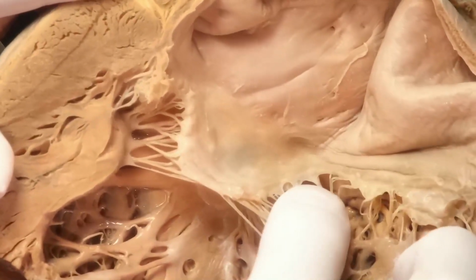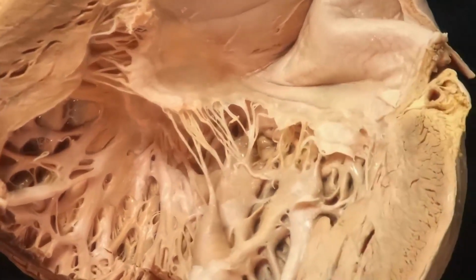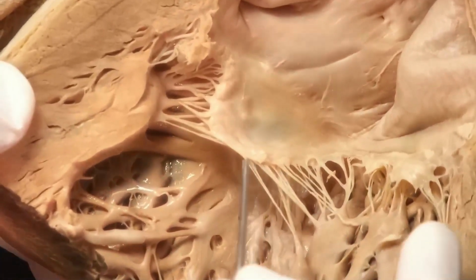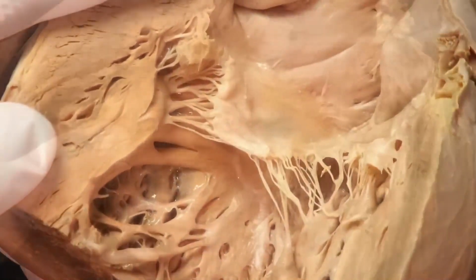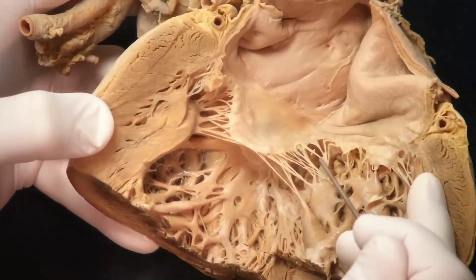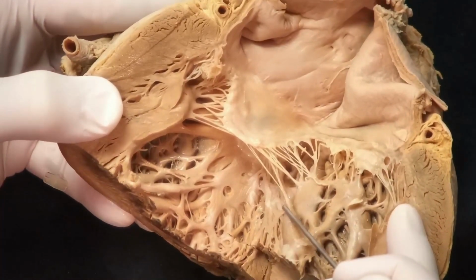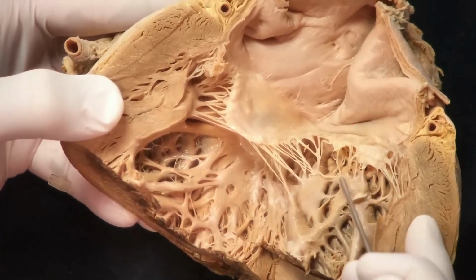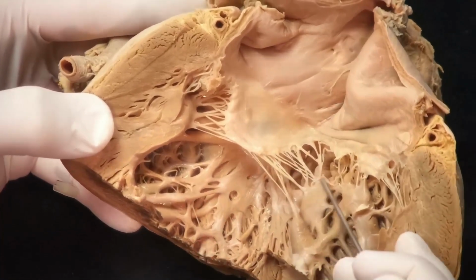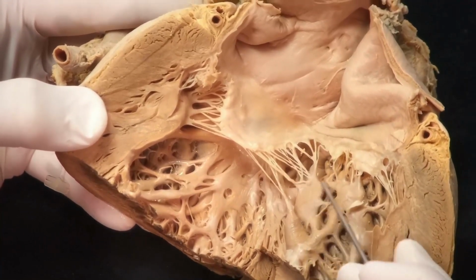You'll then see narrow regions here towards the commissures and then going into the posterior leaflet there, where there are fewer cords perhaps, and we could then clip the posterior leaflet to the anterior leaflet in that region. One thing just to note in passing is that we have cords arising from one papillary muscle supporting both leaflets, and often that's misrepresented in many of the textbooks. So you've got the papillary muscles, the papillary muscle heads, like the fingers of a hand, they're supporting these fan-shaped cords, and cords arising from one group supporting both leaflets. And this is the more complicated commissural region of the leaflet.